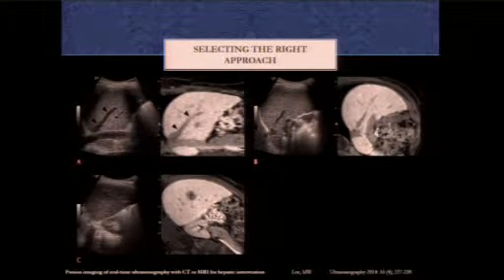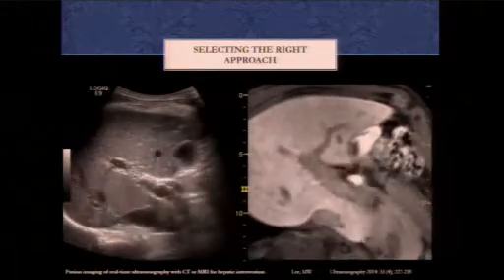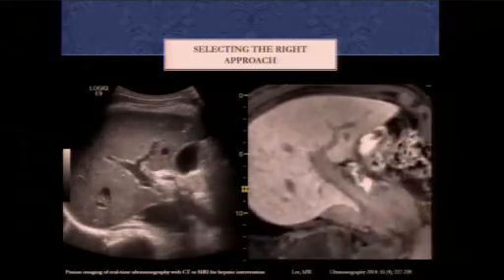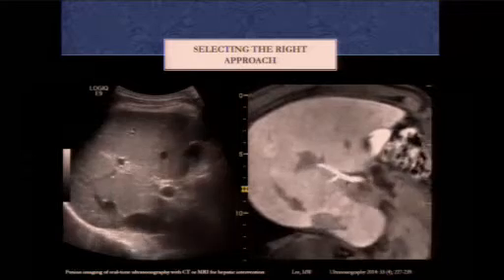There's also the way of using cross-sectional imaging to basically guide your ultrasound drainage. So the computer will link up, based on a pre-procedural cross-sectional scan, your images and help you discern kind of deeper structures. And sometimes if there's perhaps a collection that you'd only see on MRI and you can't see it on ultrasound, this will help you target where it is. So this is kind of what it looks like as you're sweeping through the abdomen. It'll give you a reconstruction image of the abdomen based on, in this case, an MRI.